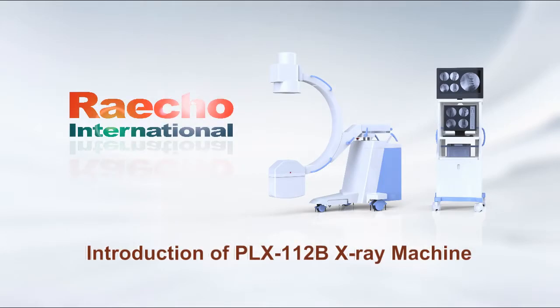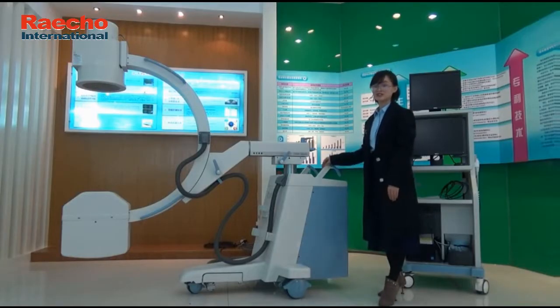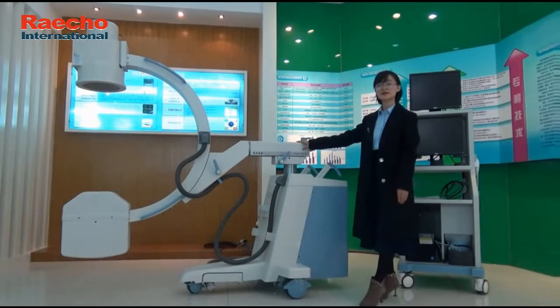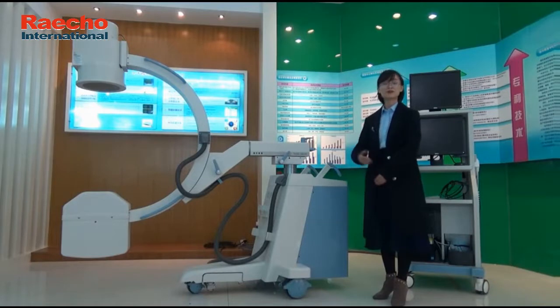Introduction of PLX-112B X-Ray Machine. The purpose of this video is to orient all of you in the use of this PLX-112B high-frequency mobile X-ray system. It is mainly used for orthopedics, traumatic surgery, spinal surgery, and operating rooms.